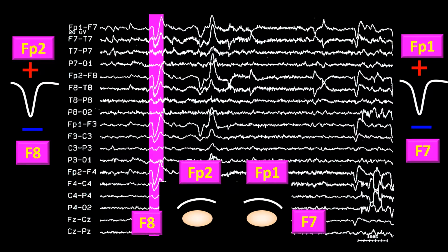So, introducing a cartoon of eyes and electrodes and reproducing the field as suggested by our prior discussion about eye fields, since we know the cornea is positive, we then can surmise that the person is looking up.